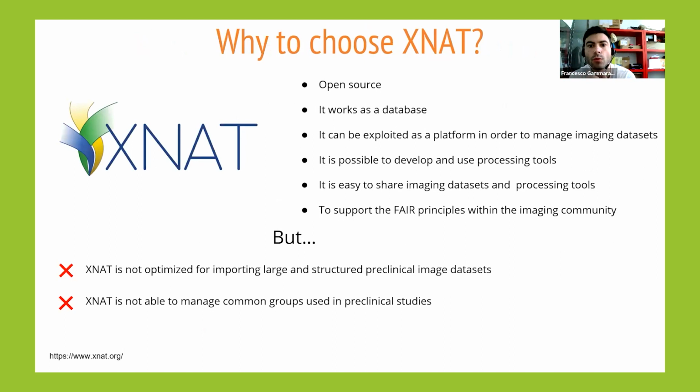But why choose XNAT? XNAT is an open source platform, and it works as a database. And XNAT is an imaging platform for managing and sharing imaging datasets. And we have the possibility to develop, use and share processing tools.